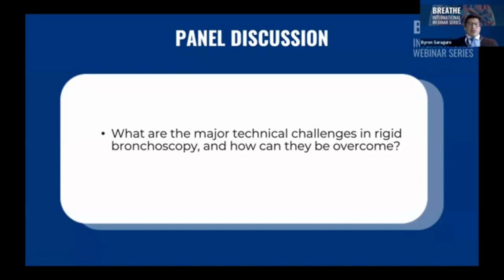As for ventilation, the particular mode of ventilation will depend on the entire team, their experience and expertise with the different methods, as well as the available options in the hospital. In some hospitals, the preferred method of ventilation is the jet technique. In Ecuador, we use controlled ventilation.